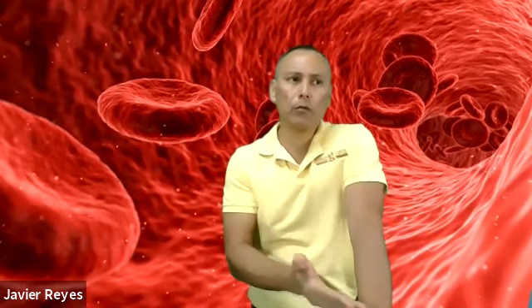So hemoconcentration is an increase in non-filterable large molecules. Some molecules, like your sugars, your proteins and so on, are not able to be filtered out of the blood, and this can be a result of hemoconcentration. It can be caused by the stagnation of normal venous flow due to the tourniquet. When you apply your tourniquet too long on the arm, you're limiting the blood flow. Remember, the purpose of the tourniquet is only to slow venous return, not to restrict. You don't want to restrict arterial flow.